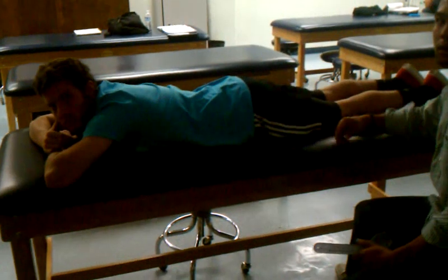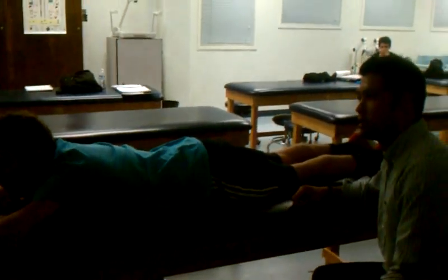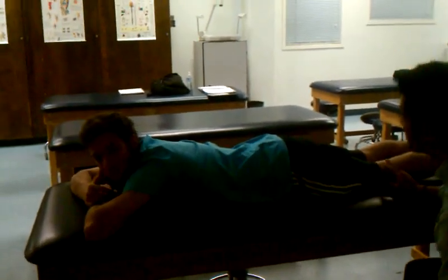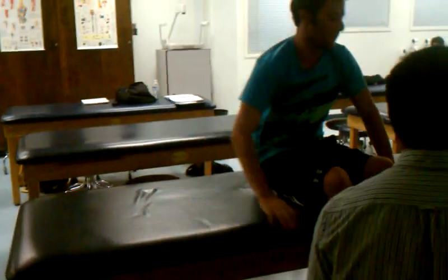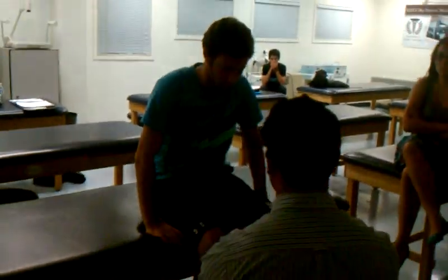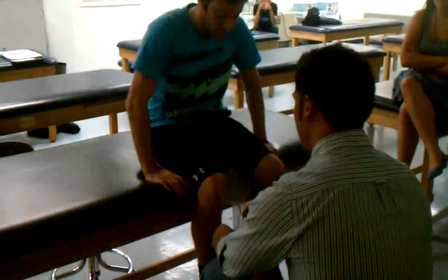At the ankle, we have dorsiflexion, plantarflexion, inversion, and eversion. For internal and external rotation — like any rotation or pronation/supination — the stationary arm can be perpendicular to the floor, pointing down or up. It's all about general reference as long as you know how they're going.